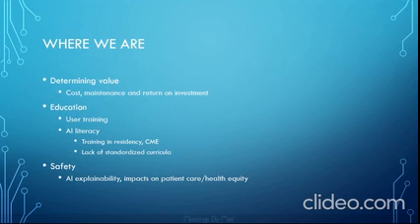Finally, we have the question of patient safety in the use of clinical AI. There is hesitation, and reasonably so, about leaving parts of the clinical decision-making process up to an AI application, especially in cases where the AI decision-making process is not understandable to human users.